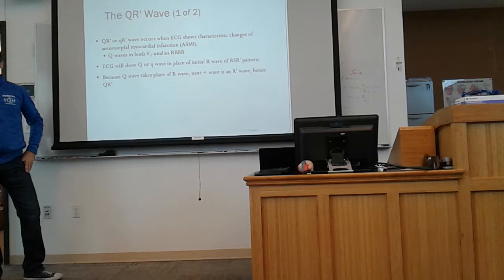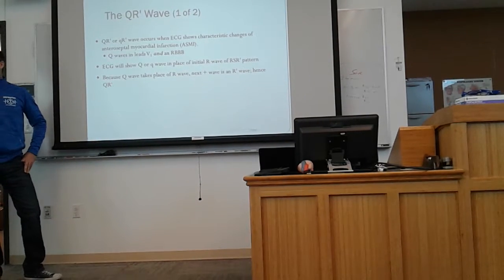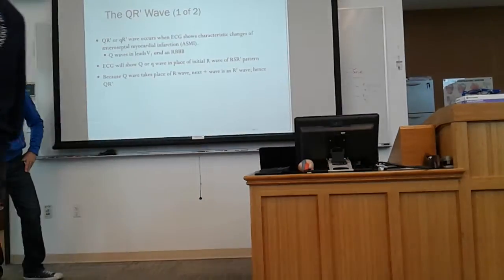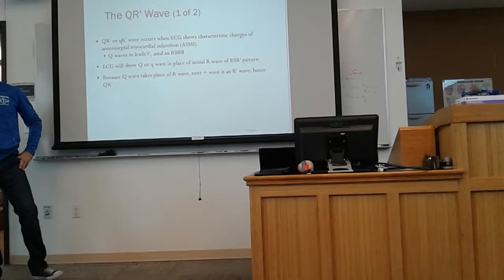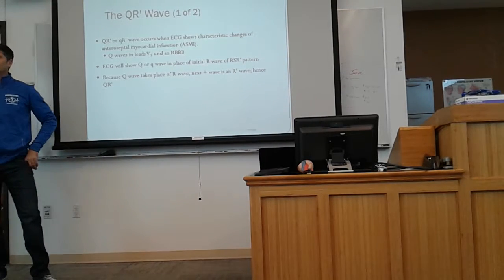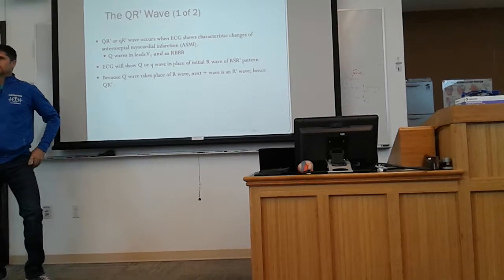It's a big Q wave and then a small Q wave. Big Q, big R, small Q, big R. Yes. Did y'all hear that? Big Q, big R. And this is a little Q, little big R. That makes sense? Do y'all remember our nomenclature? Whether it's a capital letter or a lowercase letter tells us the relative size within that QRS complex. There's no measurement, it's just that one looks quite a bit bigger than the other. There isn't an exact measurement. It's a way of being able to, in a written way, say this is roughly what I've seen.